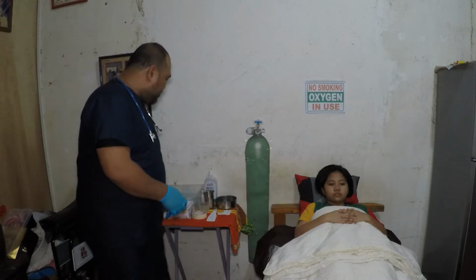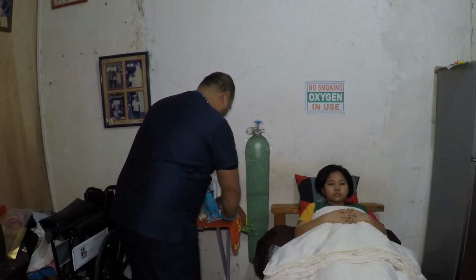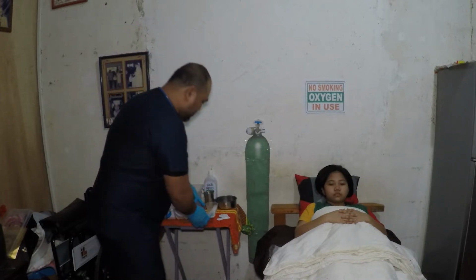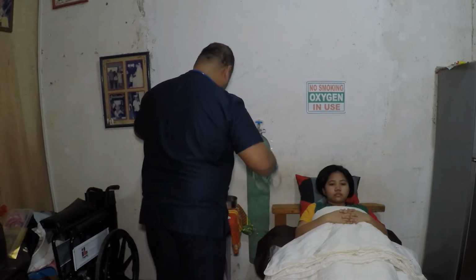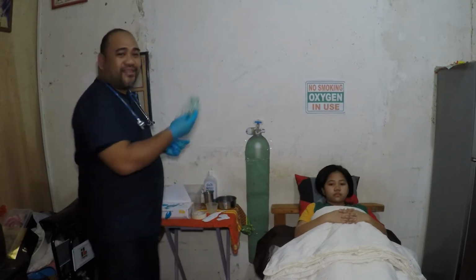So these are the materials needed. The client's chart, which is the Cardex, the oxygen connecting tube, the flow meter, the humidifier with sterile water, the oxygen source, a tray with the nasal cannula of appropriate size or oxygen mask, the kidney tray, adhesive tape, and scissors.